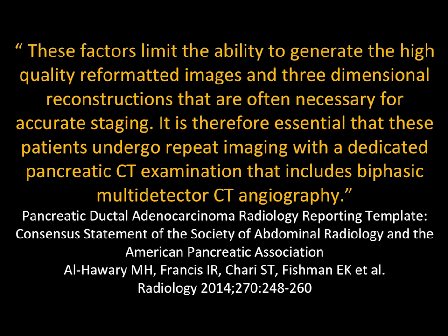These factors limit the ability to generate high-quality reformatted images and three-dimensional images that are necessary for accurate staging. That is, if you don't do dual-phase imaging, if you don't do thin sections, you can't do what's necessary to do the right staging and give the right information. So again, when I talk about protocols, the protocols drive everything. It drives your ability to be able to report correctly on templates.